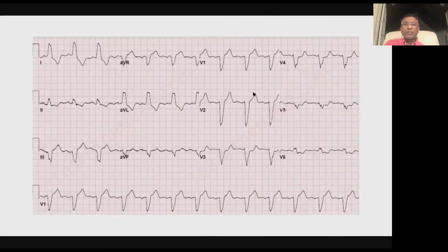So again, a typical left bundle: look at this, almost no initial R wave, very sharp downstroke in the initial onset of the QRS complex here in lead V1. Also note lead aVR, another helpful lead to look at when deciding if this is VT or SVT.